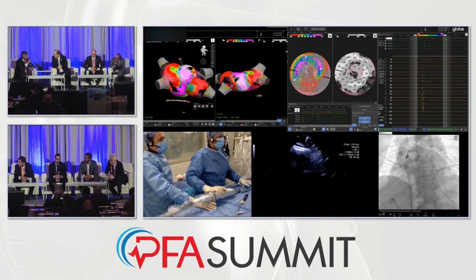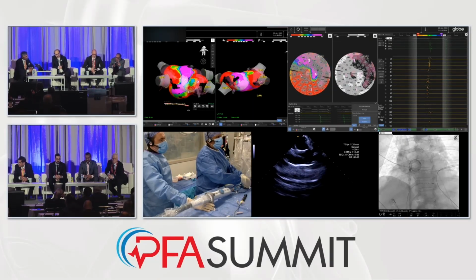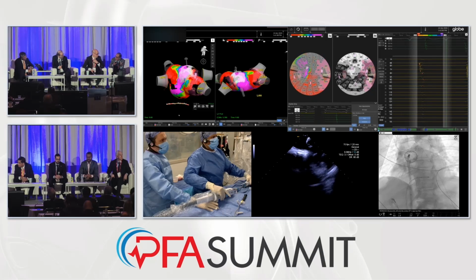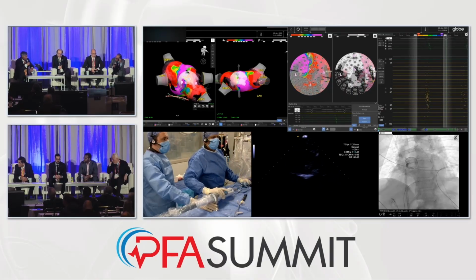When you're not sure if your contact is good, you've got to work more on the waveform or the positioning in order to get good durability. Are there any situations where the atrium is very dilated or the pulmonary vein ostia are very big? You end up being closer to the ostium with this type of technology because you have to push it against the... Well, it's pretty big.